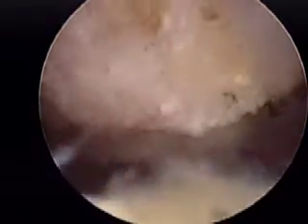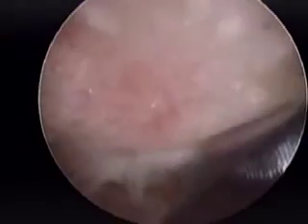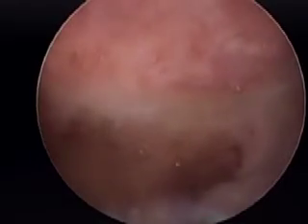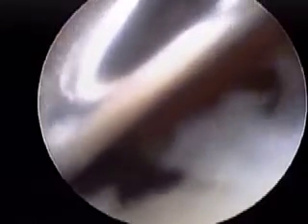Now we are cleaning the lateral gutter, which in my opinion is a very important step to see the subacromial space. Now we are seeing the anterolateral aspect of the acromion, and from the lateral portal, we are performing a very slight and simple acromioplasty. Now the acromioplasty is finished, and then we move the portal. Now we are watching from the lateral portal. This is the acromion, and now with a spinal needle, we are establishing an anterosupralateral portal. Now through the anterosupralateral portal, we are cleaning the tip of the acromion just to see the acromioplasty.